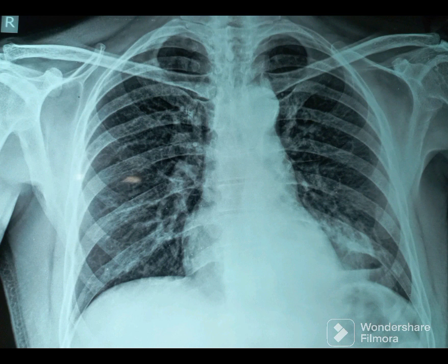The commonest cause is hydropneumothorax — that is, both air and fluid in the pleural space. The next common cause is fluid in a lung cavity. Fluid in a lung cavity can occur in lung abscess or in lung malignancy.